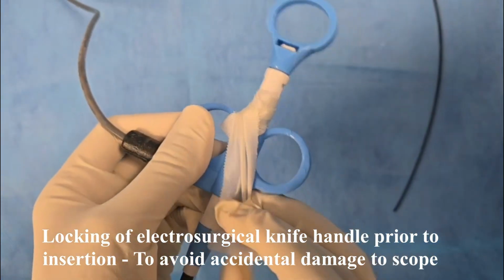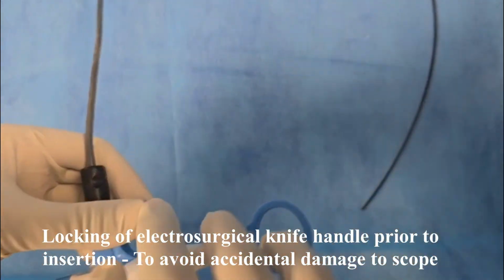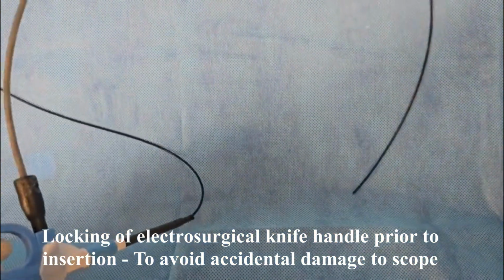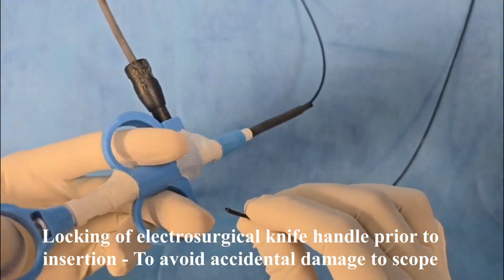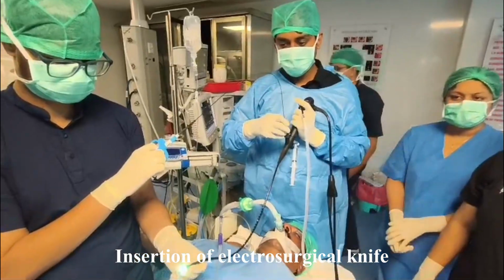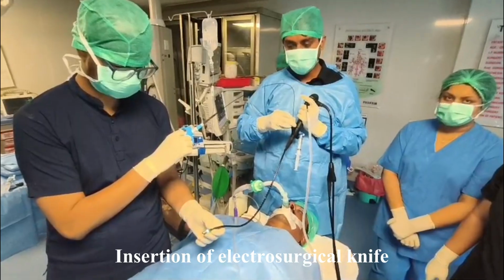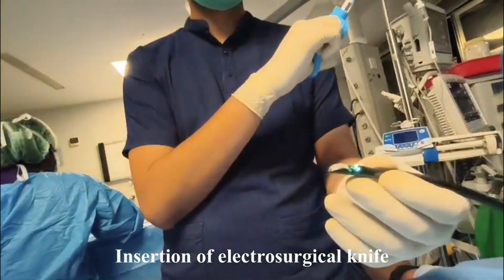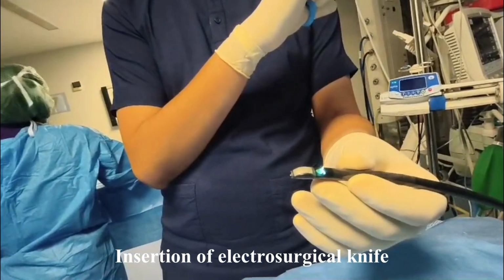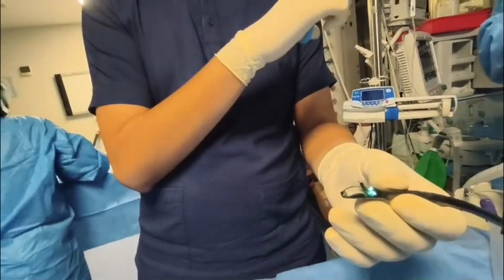of the electrosurgical knife into the working channel of the EBUS scope with the help of a tape. Sometimes you can even use a locker. As you can see from the picture here, as we lock, it prevents the electrosurgical knife from opening inadvertently. Now, after locking it, we are introducing the electrosurgical knife through the working channel of the EBUS scope, and this prevents the accidental damage of the EBUS working channel by the open needle.